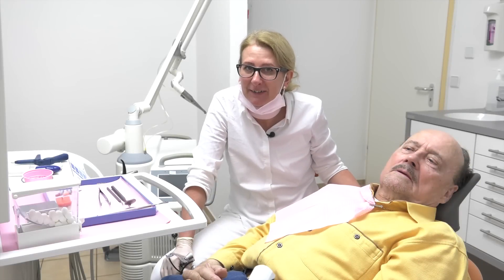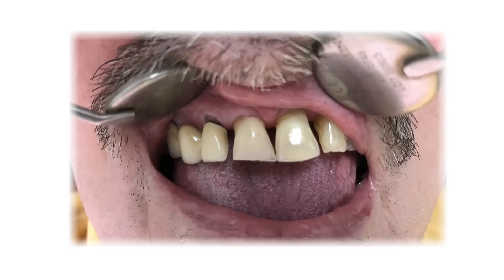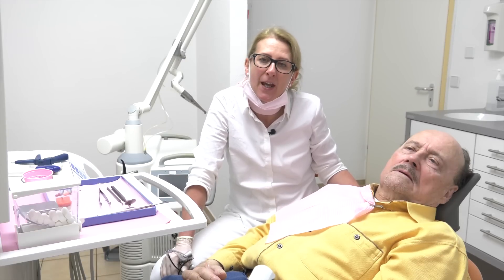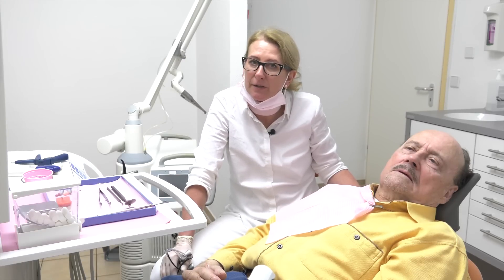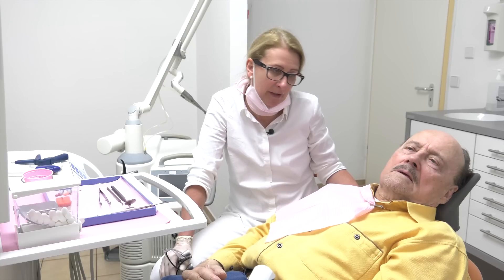The filling is done. Just have a look at the picture after — you must say that the anterior incisor looks very, very good. And the treatment is almost painless, and you avoid the artificial crown. And the treatment is very fast.